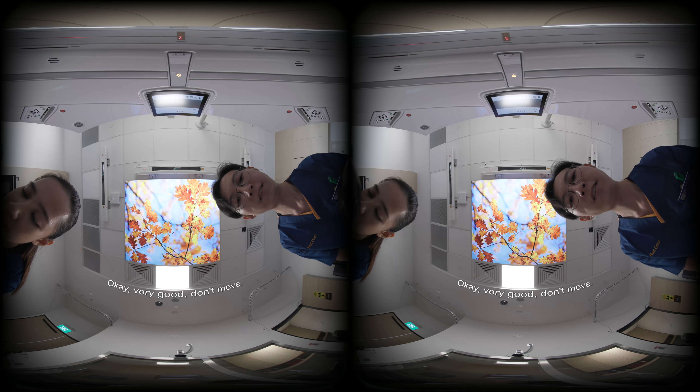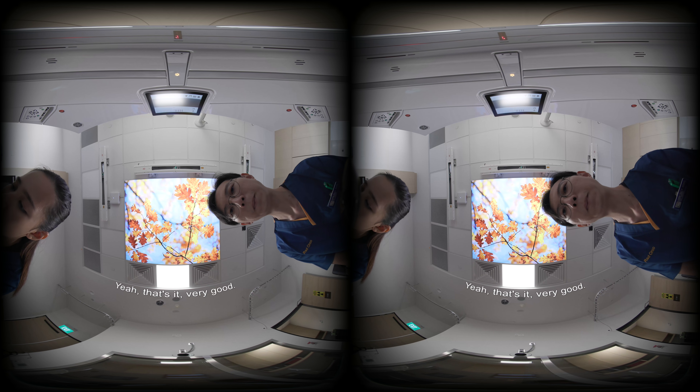Very good. Don't move. Yep, that's it. Very good.